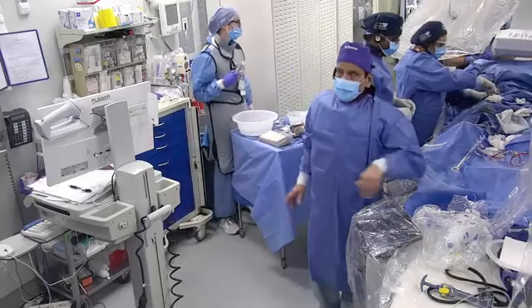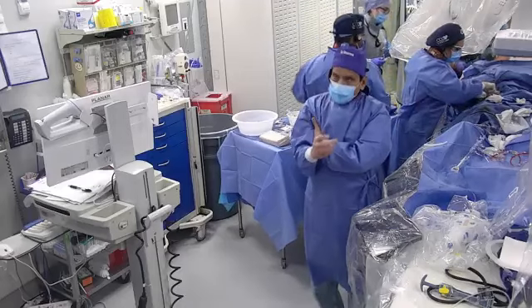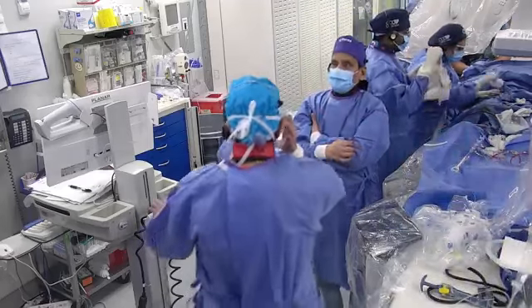The only question will be like a vein graft, where you have a thrombotic lesion, the thrombus is there, and there is calcium. Laser will be very good in that situation.